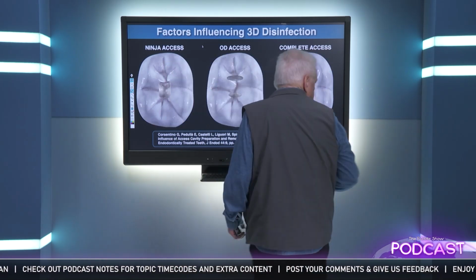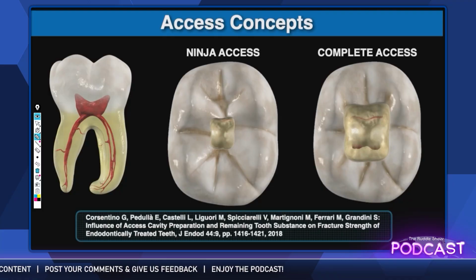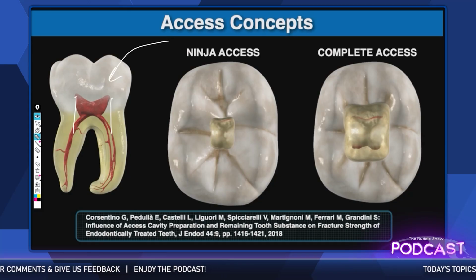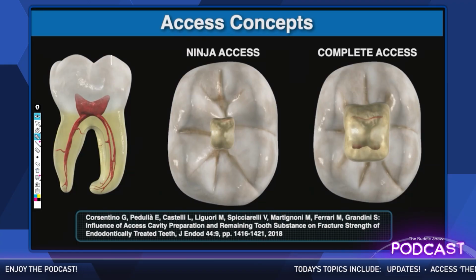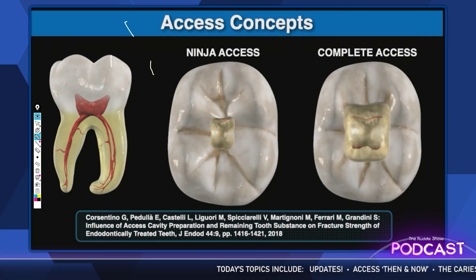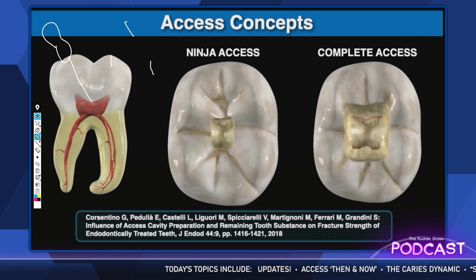Okay. And then maybe we've been beating this to death. Sometimes, since you're coming in like this, front of the mouth, you don't need to take out that triangle because you can just kind of come in here and drop right in. So fine, that's good. But it's much, much different to come over the marginal ridge. Now you have to stand the file up. But no, you got to stand it all the way over to here so you can start to have a handle over here like this, and you're starting to come in like that.